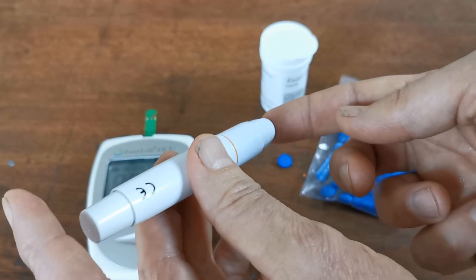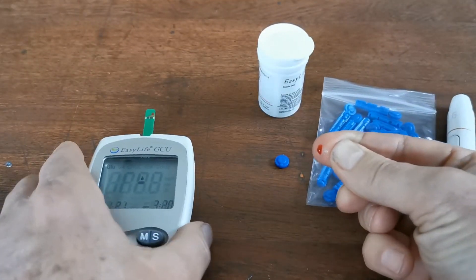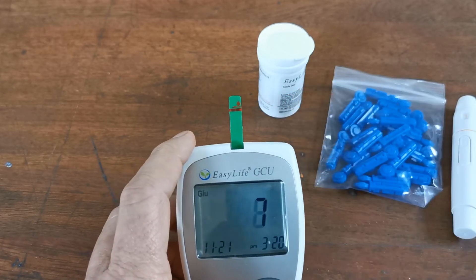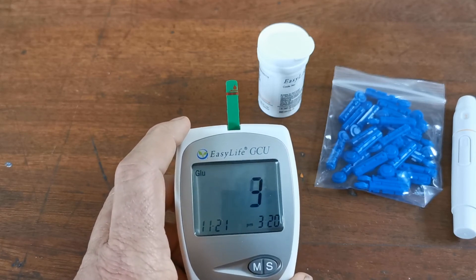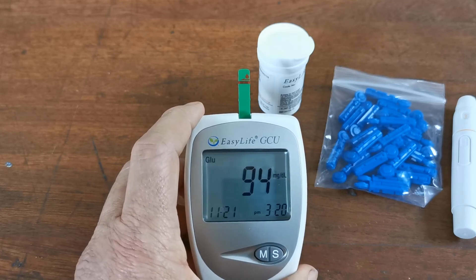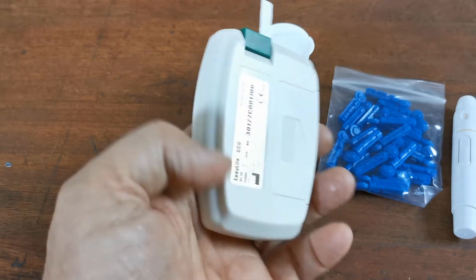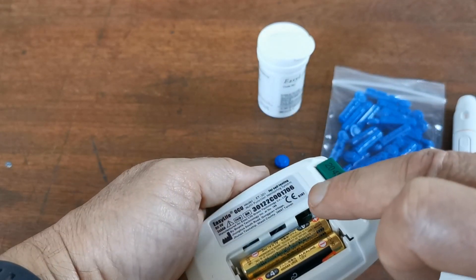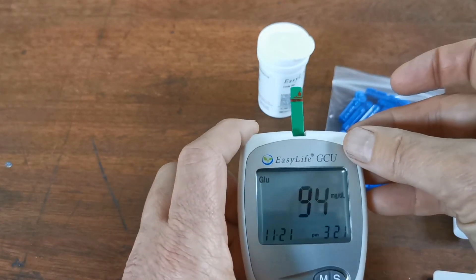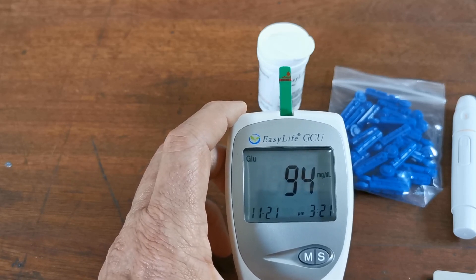Apply the lancing device firmly against the pulp of your finger and release the trigger — you should get a drop of blood forming. Present this to the side of the test strip and you'll see it run through. As soon as sufficient blood has been absorbed, the countdown starts. There is my blood sugar in milligrams per deciliter: 94. If you want this displayed in millimoles per litre, you can alter it using a small switch on the meter — just use a pen or a pair of scissors to flip it to the alternate setting. This allows you to display in whichever international unit you choose.